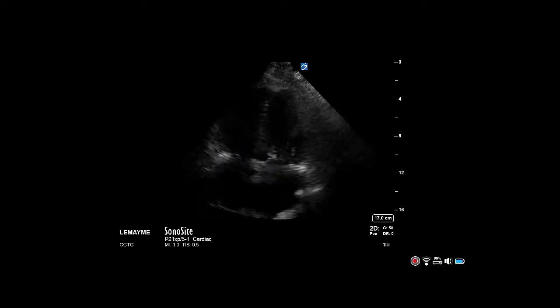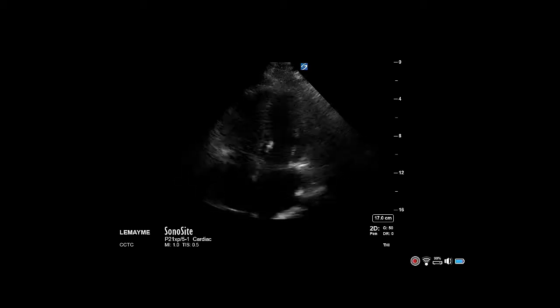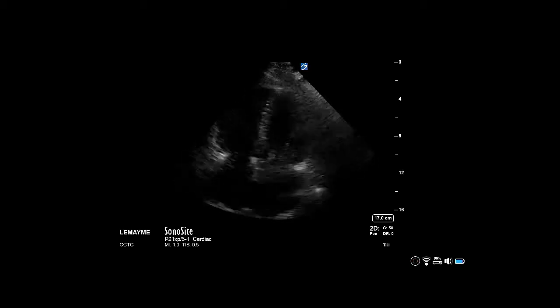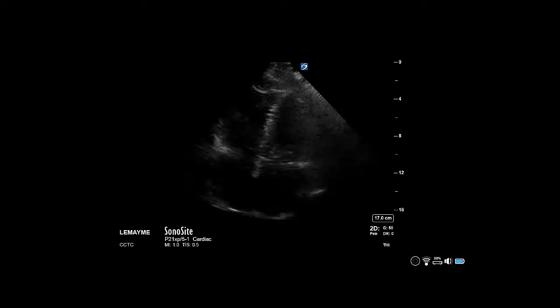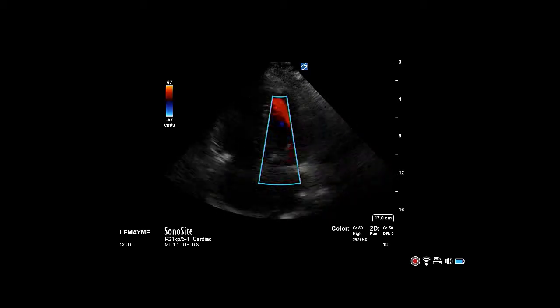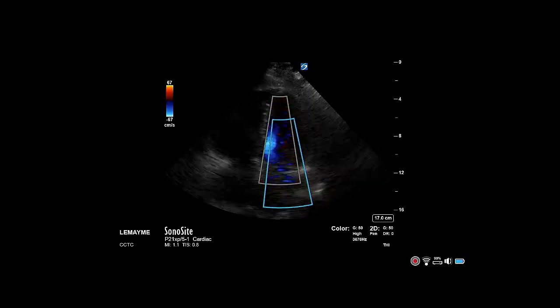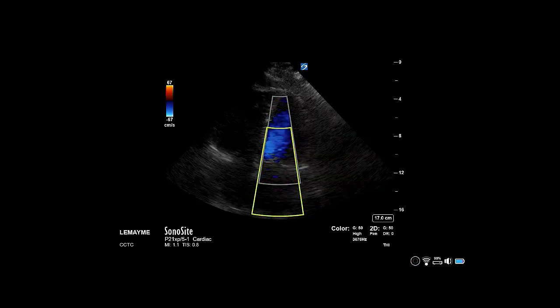The severity of mitral stenosis can be assessed by the magnitude of the gradient across the valve. Begin by obtaining an apical 4-chamber view and placing a color box over the mitral valve, including the atria and the inflow.